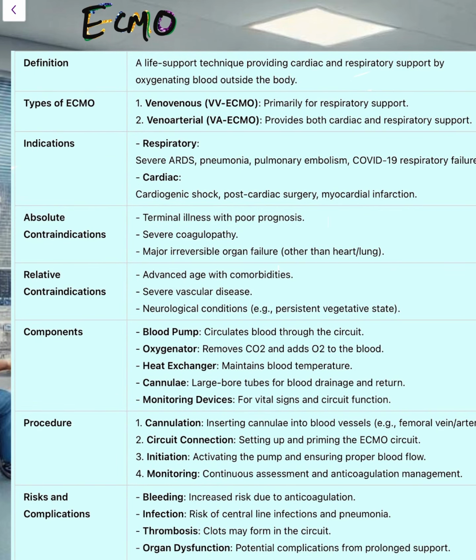Let us now discuss ECMO, that is extracorporeal membrane oxygenation. What is it? It's a life support technique which provides cardiac as well as respiratory support by oxygenating the blood outside the body. There are mainly two types, veno-venous and veno-arterial ECMO.